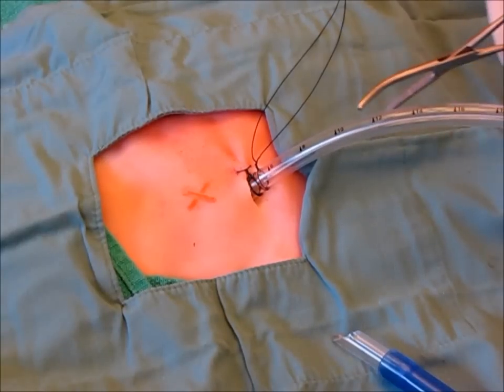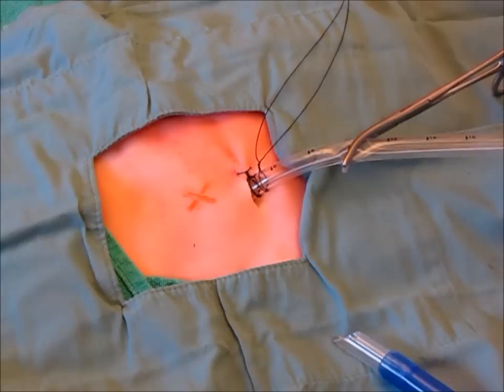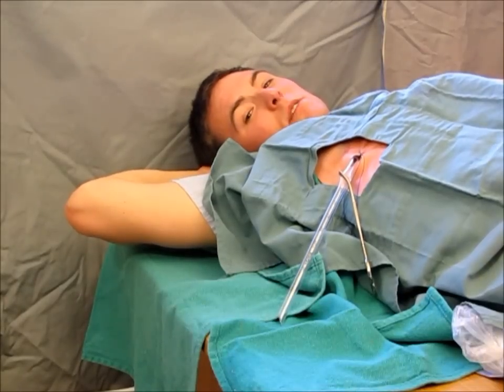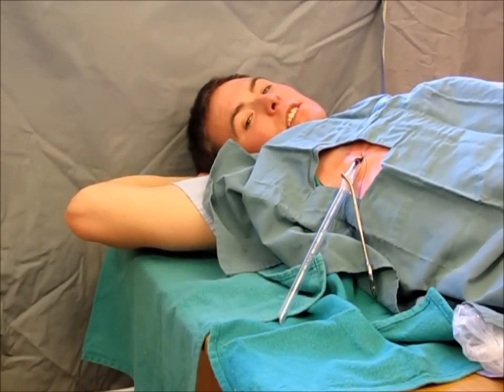When priming the drainage system, it is essential to clamp the chest tube, thereby preventing a sucking chest wound. Now that the chest tube is in place, secured and clamped off, it is time to prime your drainage system.